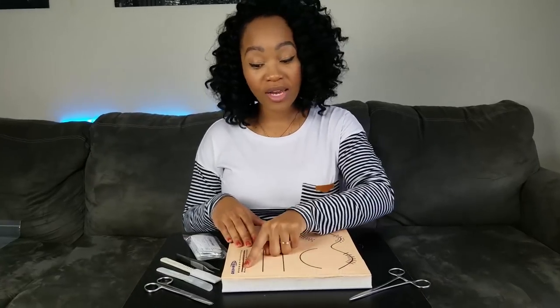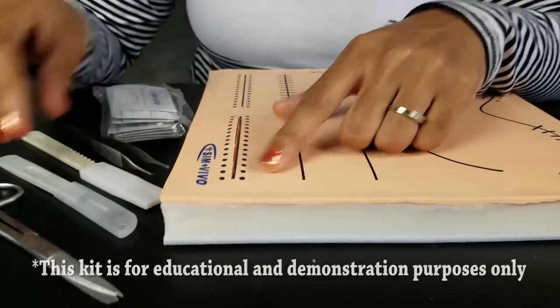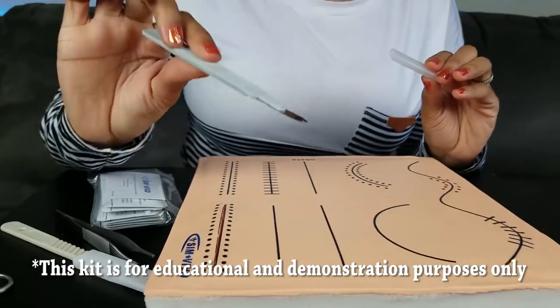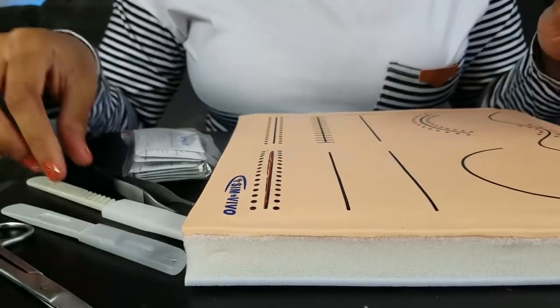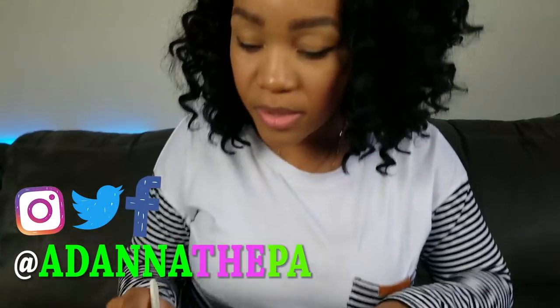So I've already made this cut here with my 10 blade. That's this right here, this particular scalpel. I cut that, but I will make another cut for you guys. I'm gonna try out the 11 blade for you. So I'm gonna do that right now.